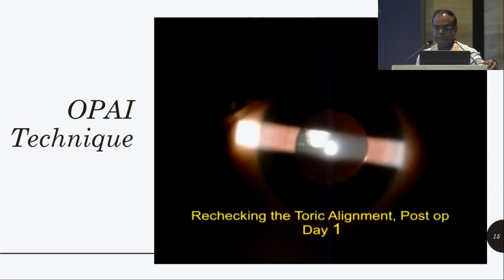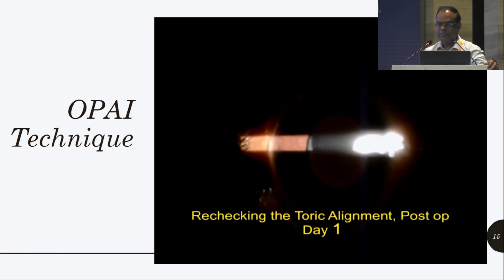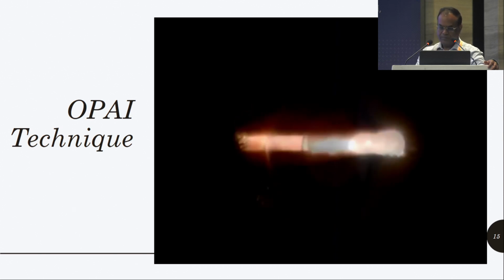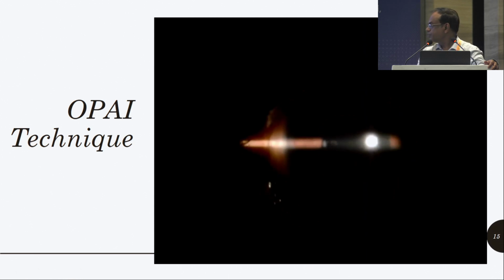Post-operative patient. In this patient, even on first post-op day, we can confirm the placement of the IOL in the bag, and we can confirm the exact axis of the lens implanted in the bag. This is the technique by which we can confirm the stability of the lens in the post-operative period, to see the rotational stability.